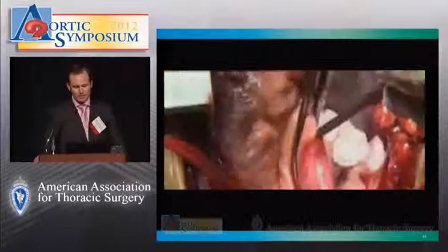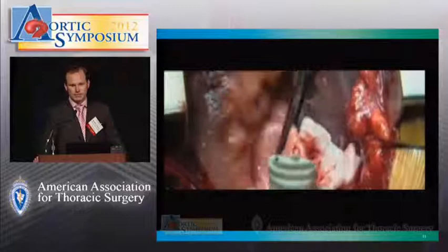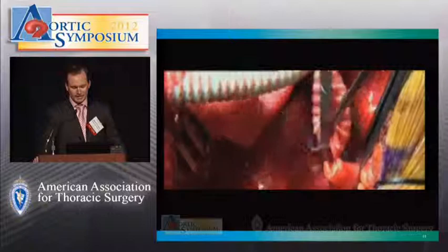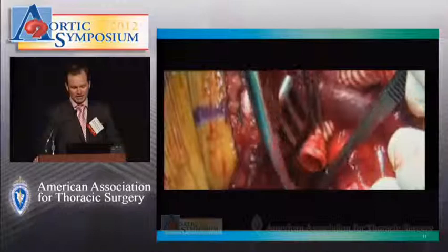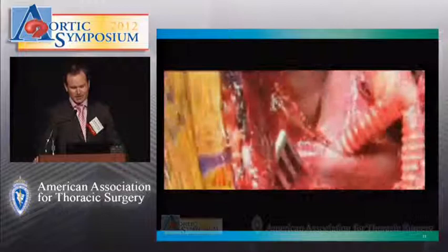A short video illustrates this procedure: tangential clamping of the ascending aorta, longitudinal incision, and end-to-side anastomosis between the proximal prosthesis and the native vessel. In the second step, transsection of the brachiocephalic trunk with an end-to-end anastomosis between the first limb of the graft and the trunk. It remains optional whether one or both limbs of the prosthesis are guided ventral to the innominate vein according to the individual anatomical situation. The second limb is then anastomosed to the left subclavian artery, and the left common carotid artery is reinserted into this branch.